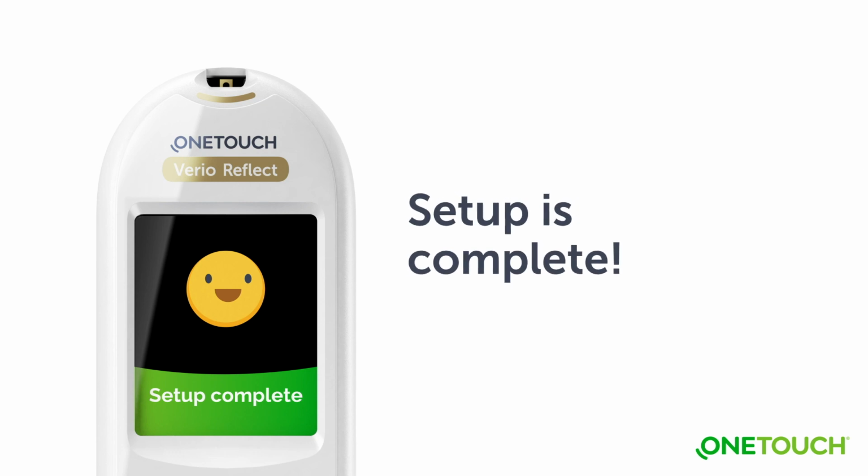There are 2 ways to turn your meter off. 1. Press and hold the OK button for several seconds until the meter turns off. 2. Your meter will turn off by itself if left alone for 2 minutes.